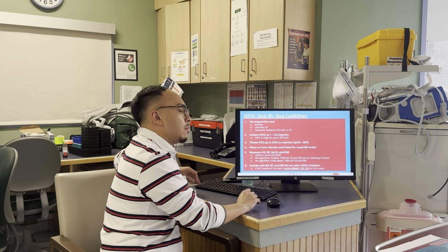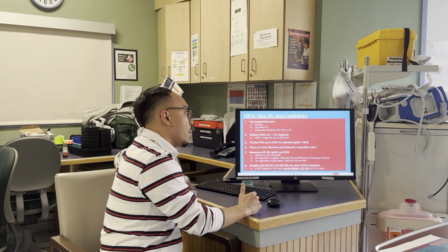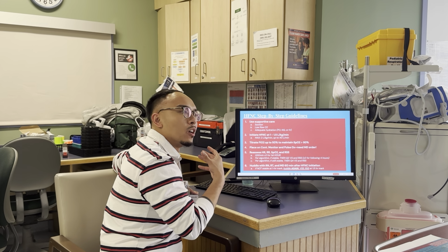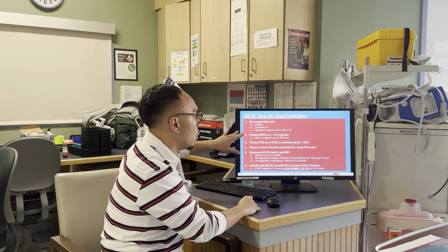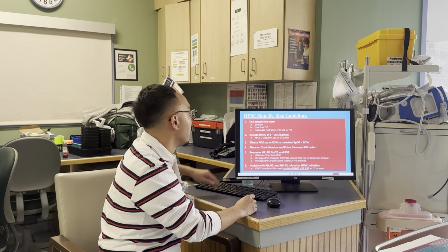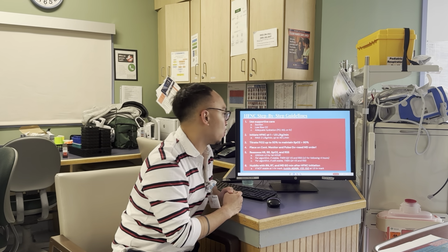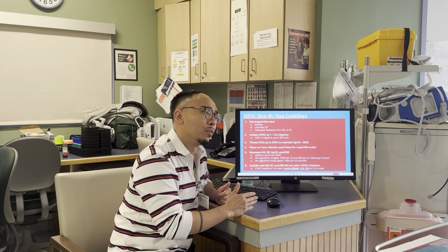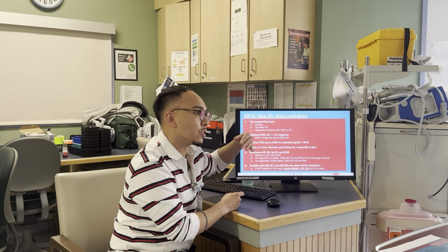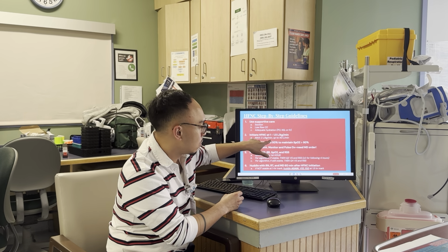So the step-by-step guide for starting a kid on high flow. Let's say a kid presents with respiratory distress, mild to moderate. The first step you're going to do is suction, right? You want to clear that airway, get all that gunk out of there. Maybe we'll start them on low flow oxygen, and then you're going to make sure they're hydrated with either PO, NG, or IV, all right? You're going to initiate high flow here at 1 to 1.5 liters per kilo per minute. So essentially you have to know what the kid weighs, and then you're going to multiply 1 to 1.5 by that number to start us on the liter flow we're going to start with. And then max here is 2 per kilo or up to 40.